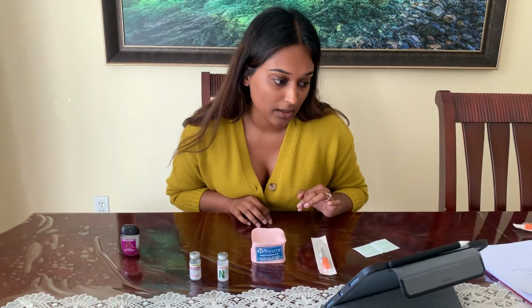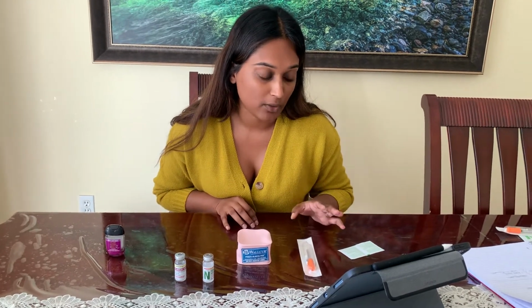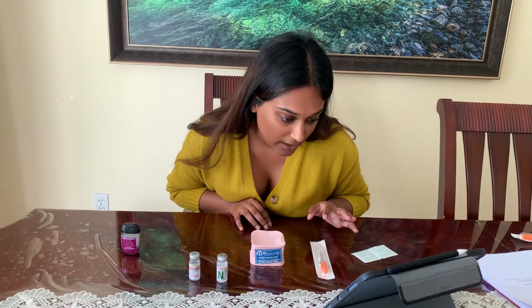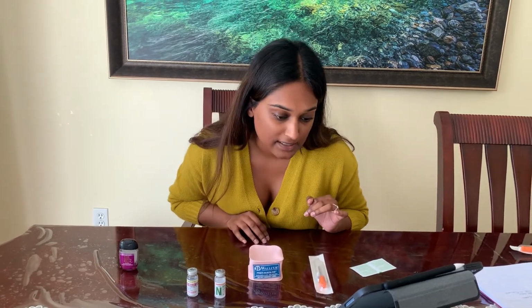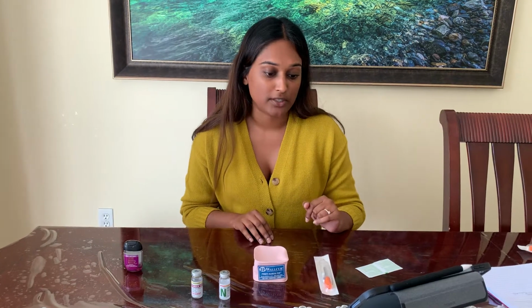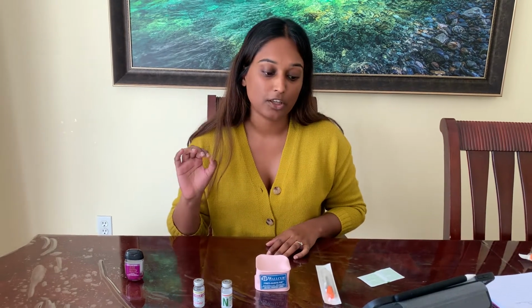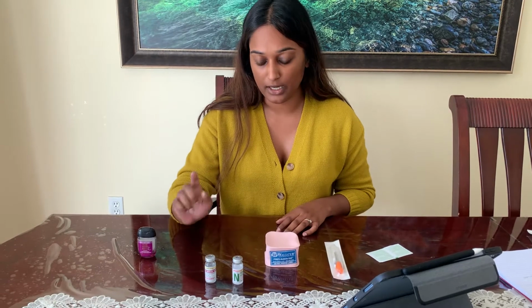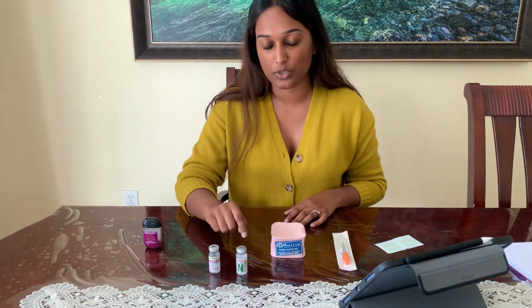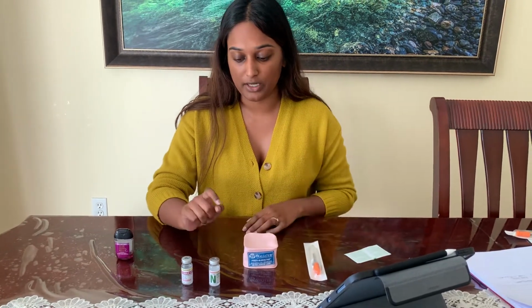As per their glucose reading of 10.6, we will be giving 4 units of the insulin Lispro, which is what we have here. The Humalog Lispro is the rapid acting, and the NPH is the intermediate acting. So rapid and then intermediate.